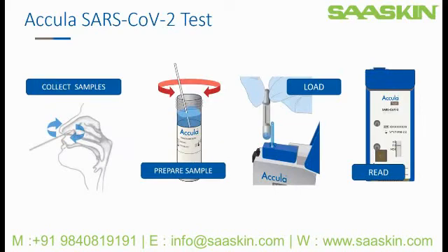This video will cover two of the steps required to run the Acula SARS-CoV-2 test. You will be using the swab provided in the test kit to collect a nasal sample from both nostrils of the patient. The swab is then prepared in the SARS-CoV-2 buffer. In other training videos, we will cover the loading of the sample into the test cassette and reading the results.